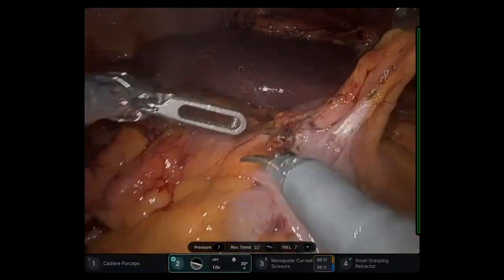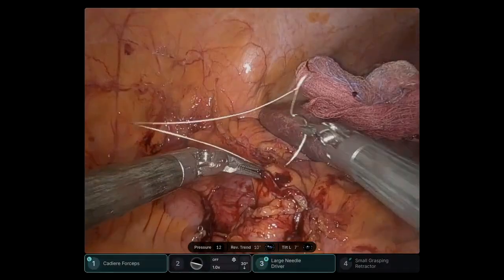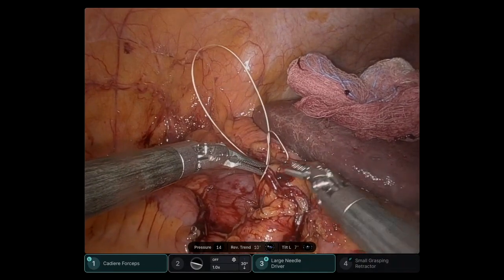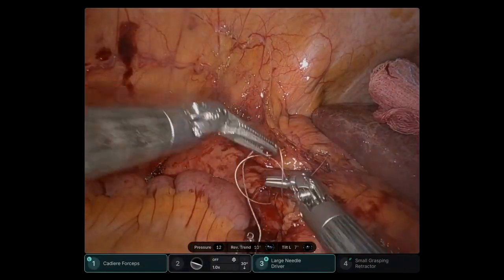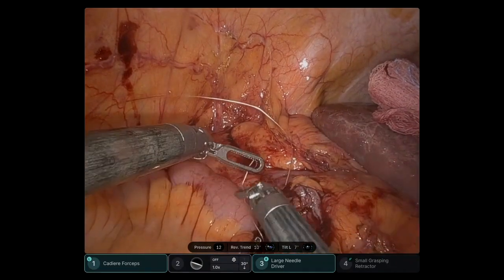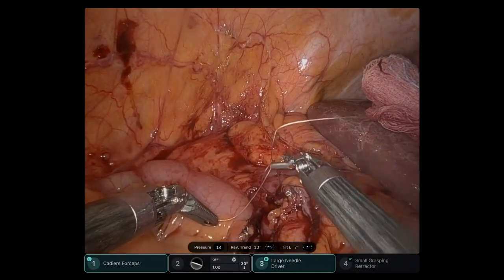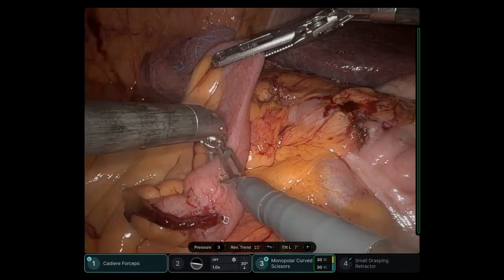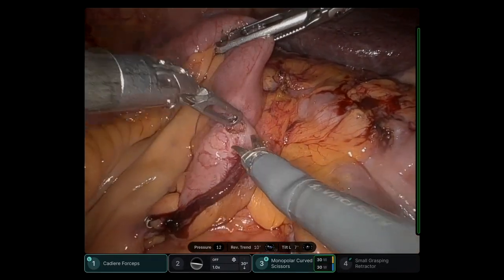I'm performing an enterotomy as usual in the transverse colon, far away from the mesentery. There was a little bleeding at the staple line, so I decided to place a figure-of-eight suture. I don't like to use too much energy close to the staple lines because there is a risk of a potential leak. Just a quick figure-of-eight, and then I continue with the enterotomy at the most distal portion of the contralateral side of the mesenteries to prevent bleeding while stapling.